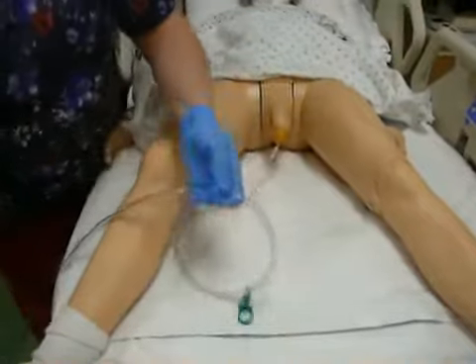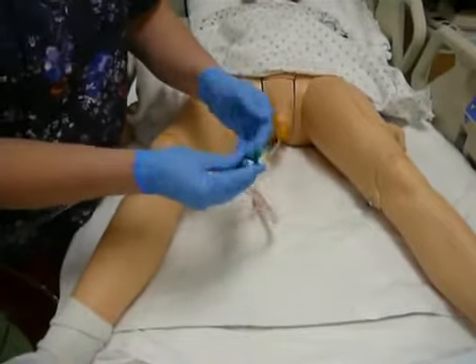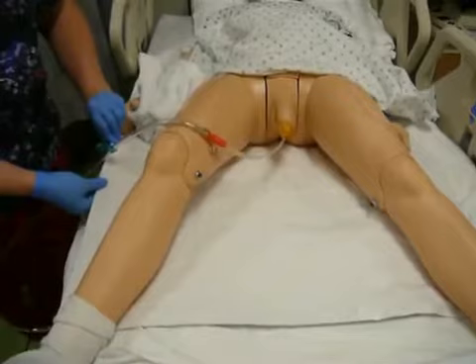I connect my catheter to a non-movable part of the bed. This is another option for a cath secure. It's the bed clip. So in case I don't have any tape, I can bring that right around and secure it to his bed like this.